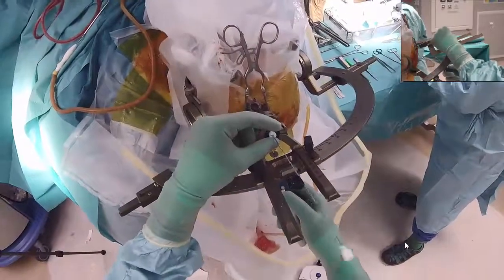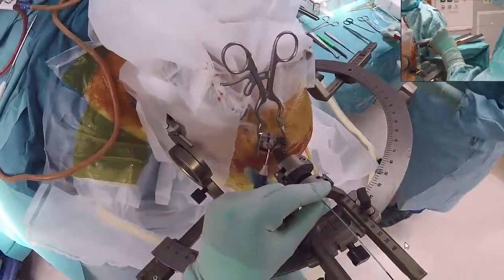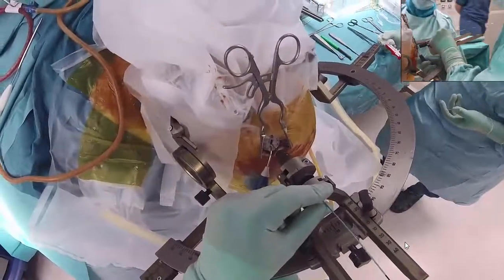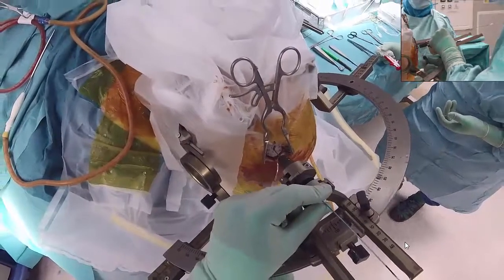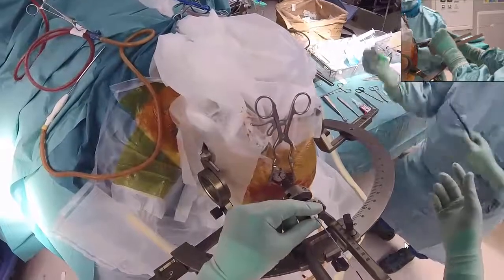When locking the electrode with the clip, make sure that the stop on the electrode is pressed towards the stop in the frame, and make sure that the lock screw is pointing in the right direction. Place the clip in the ring and lock the electrode by pushing the bottom.